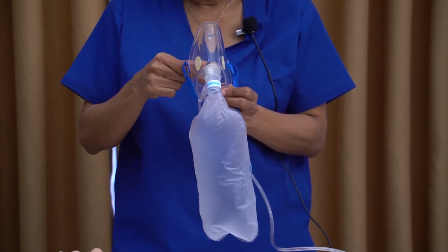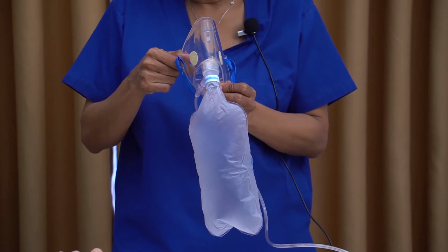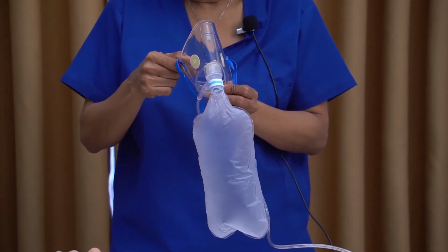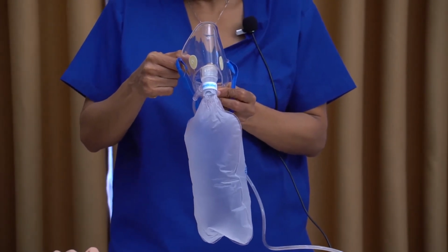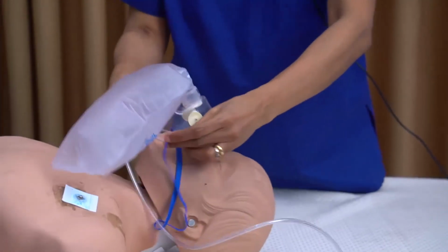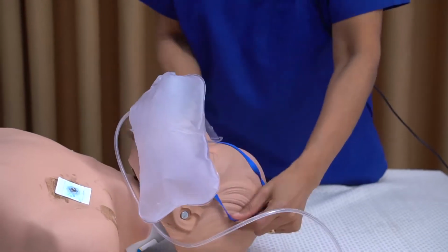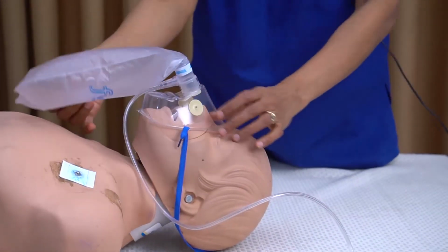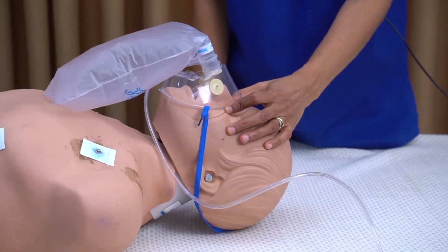In this way, we can provide up to 60% oxygen with a flow rate of about 10 liters per minute, and up to 70 to 80% oxygen with a flow rate of about 15 liters per minute. In fact, the face mask should be close fitting, so that when the patient takes a breath, the bag should collapse.